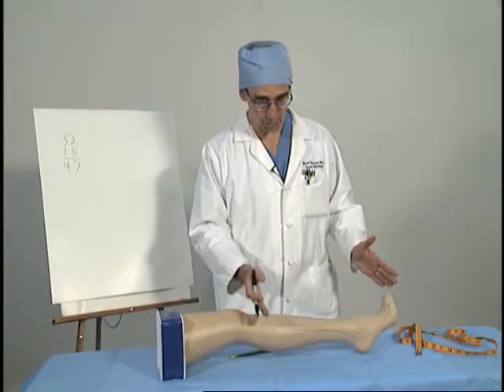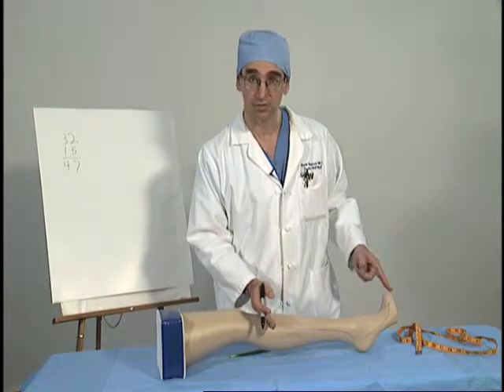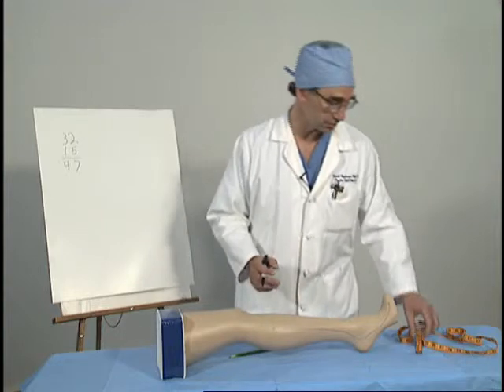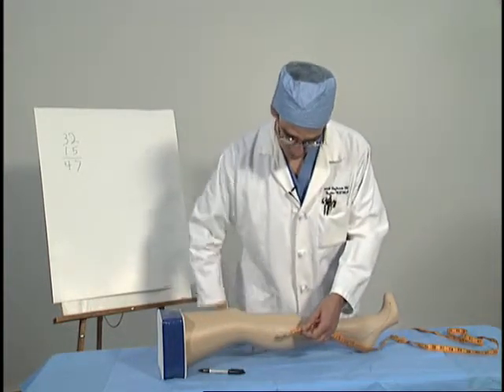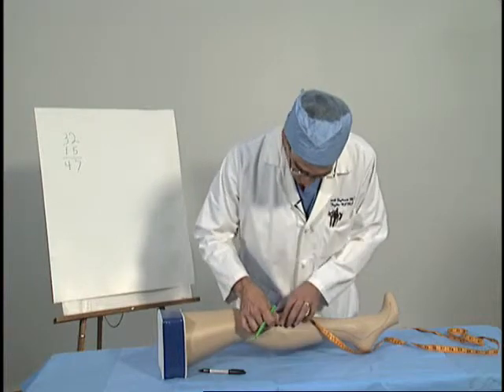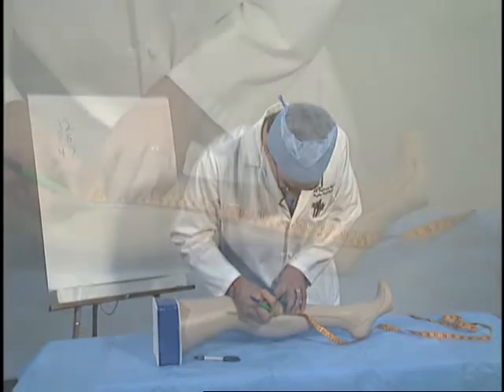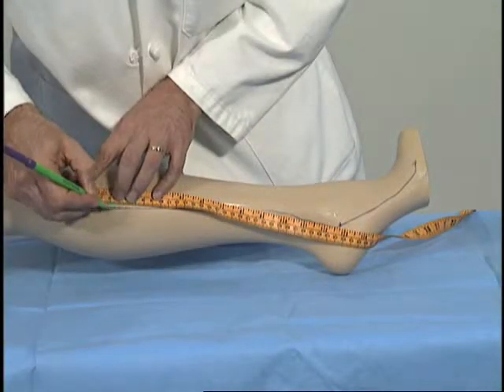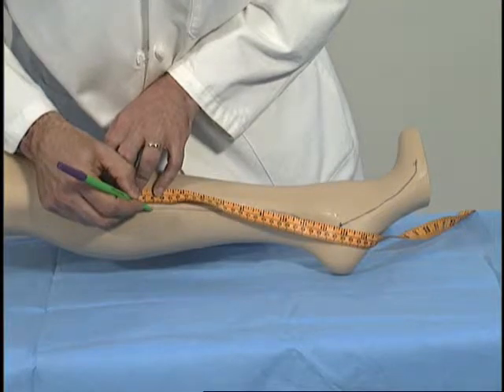So we're going to want 40 injections along this 47 centimeter length of treatment, so about 11 millimeters each. We'll mark those preoperatively with our indelible marker. We'll mark out on our line every 11 millimeters down the entire length of the leg.